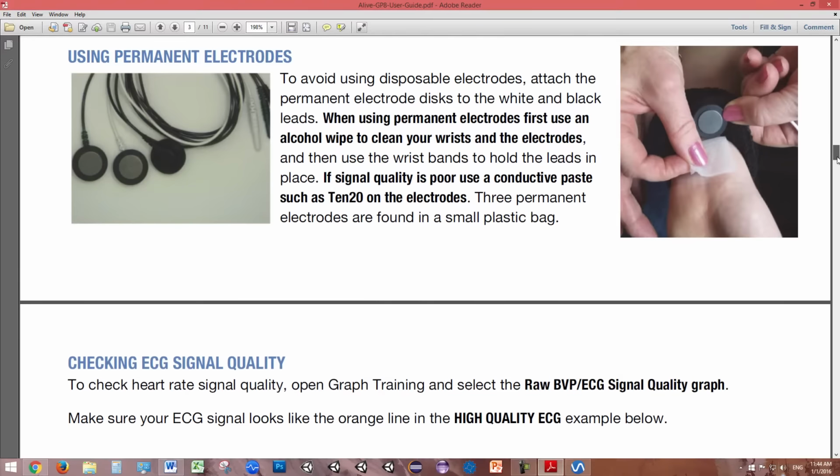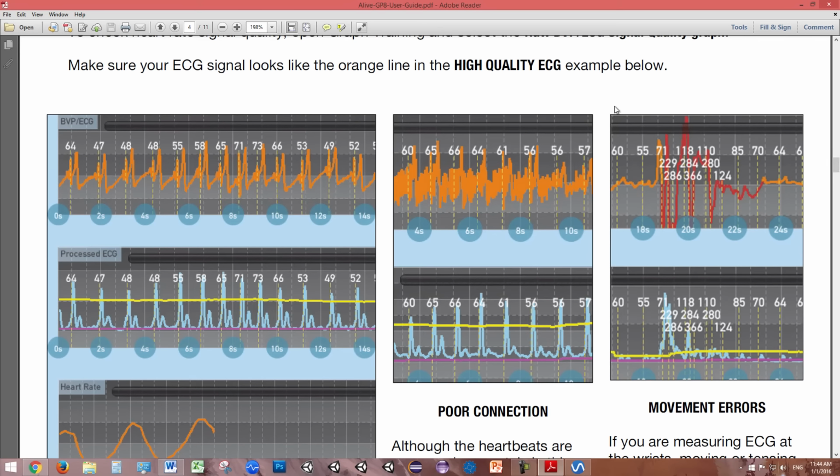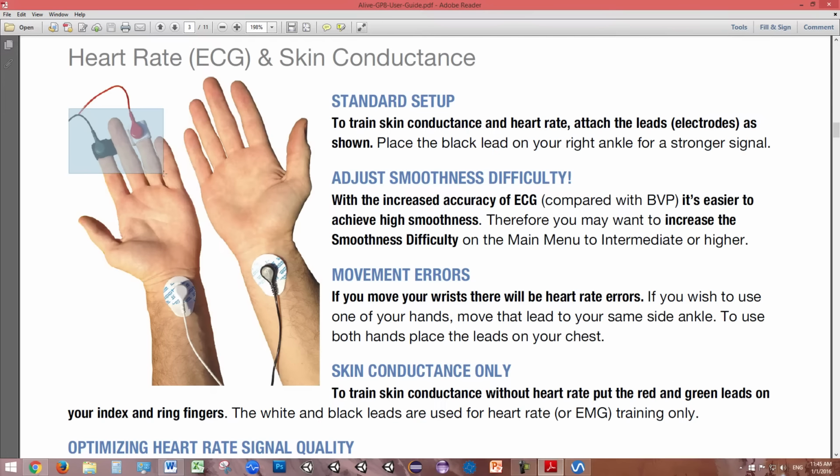If you're training wrist to wrist, moving your hands will cause movement errors. So if you want to play a game like Dual Drive, move one electrode to the ankle, or put the white and black leads on the chest. You can place the green electrode anywhere, but if you're going to also train skin conductance, place the green and red electrodes on the index and ring fingers as shown.